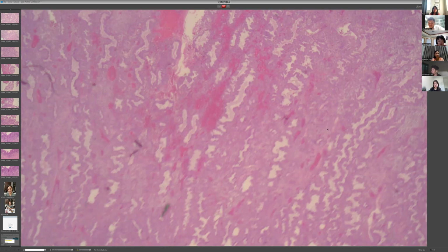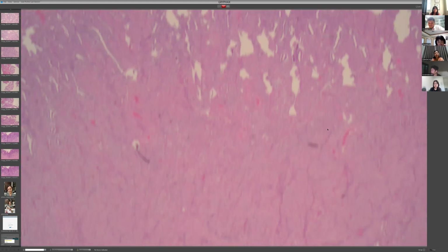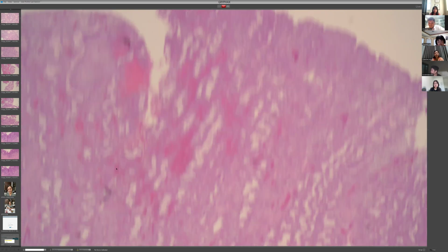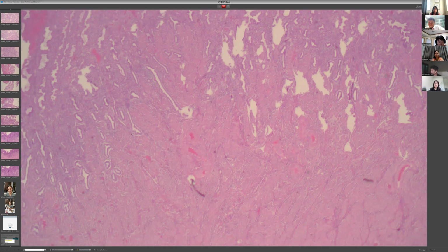Again, sorry, this is a surgical specimen. We have the myometrium, and then we have the secretory functionalis layer here. We have the elongated, long, tortuous glands going all the way to the top with secretion. Then we see contrasting, inactive, small, rounded glands at the bottom, at the junction where your endometrium and myometrium meet.